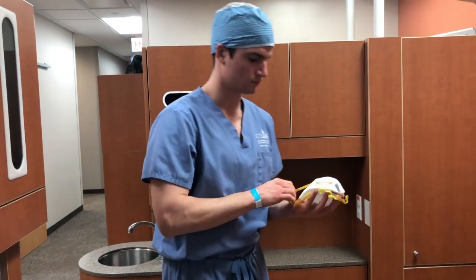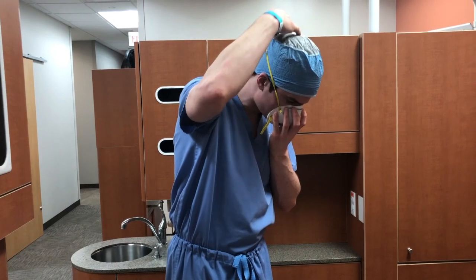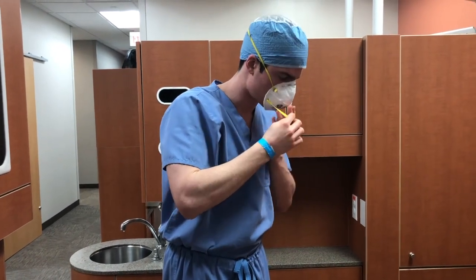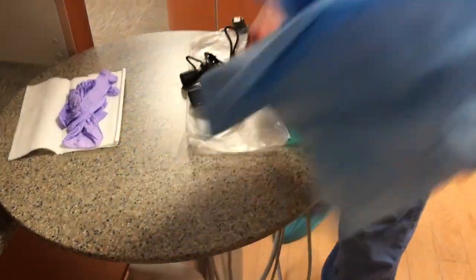Place your N95 respirator on first. Cup the respirator in your hand and pull first one headband, then the other, over your head. Mold the nasal bridge with two hands and check for a good seal. Next, put on your gown.